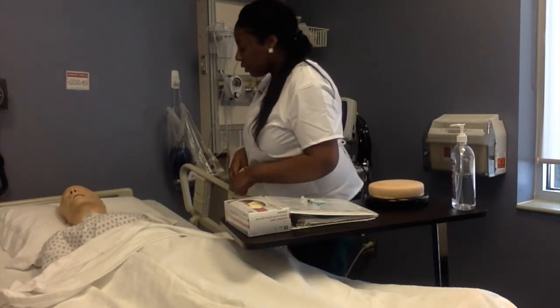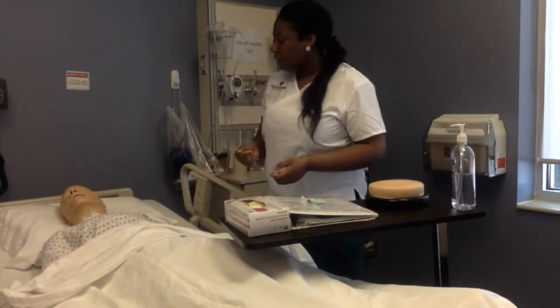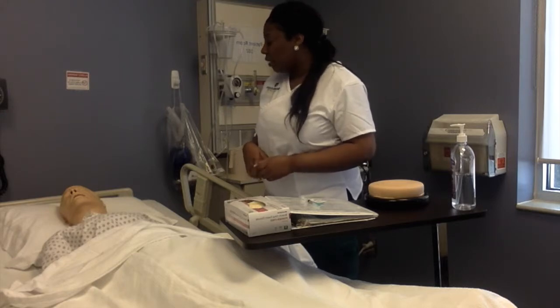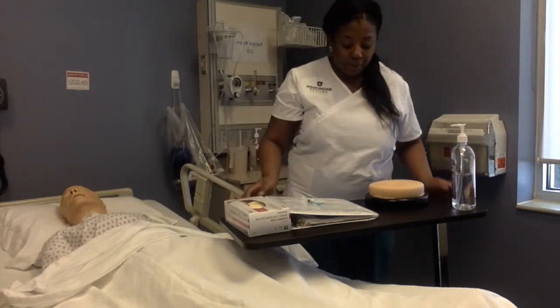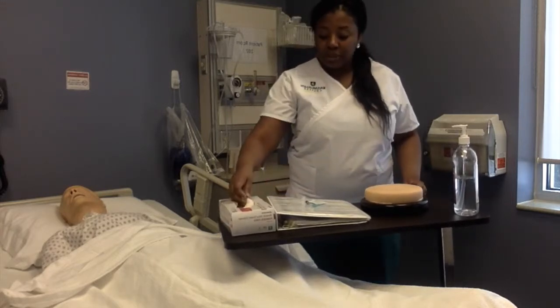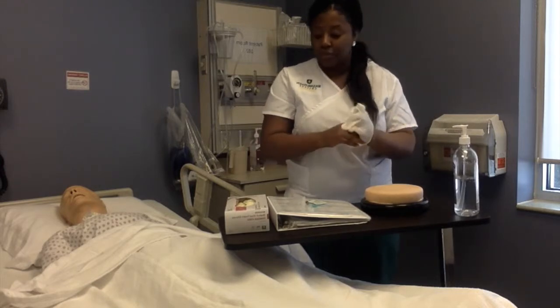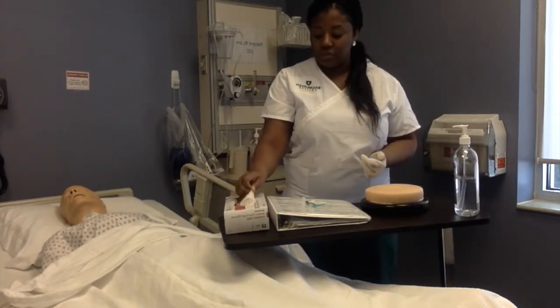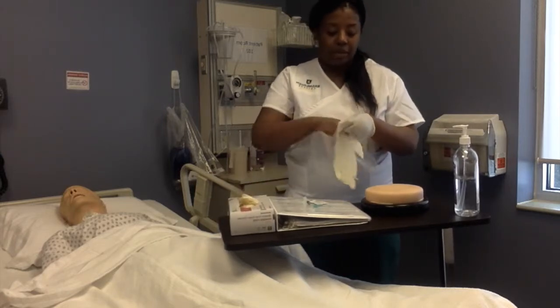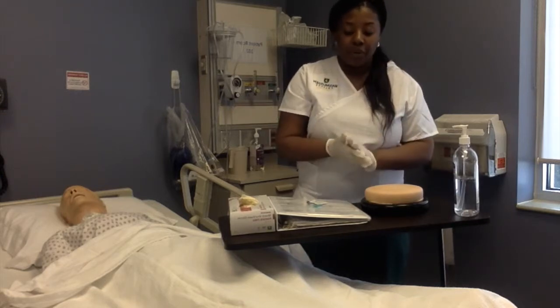Okay, so do my assessments. Okay, so it looks like everything has checked out. Do you have any questions before we begin? Okay, all right, so before, I'm going to put on some clean gloves before I start my injection. And I want to locate my landmarks for my injection.